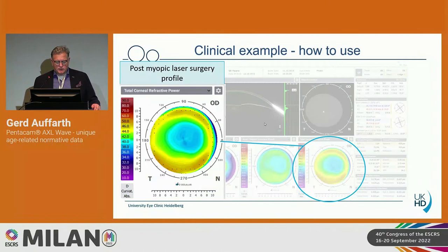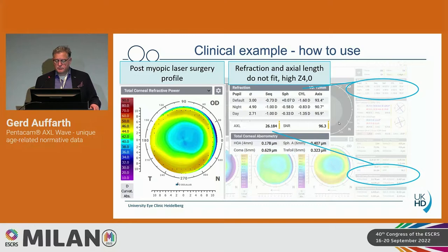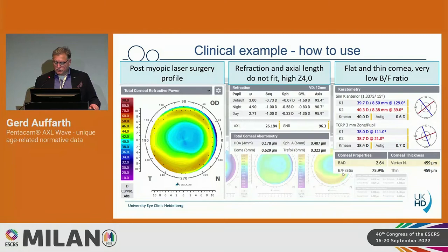Here's an example of a post-myopic laser surgery profile. On the total corneal refractive power map, if you look at the axial length, this should be a myopic eye, but it has only a refraction of minus one or even less — so the laser vision correction process can be identified. High order aberration with spherical aberration of 0.4 is fairly high. The flat and thin cornea and back-to-front ratio at 75.9% — if it were around 80%, it would be a normal eye — all confirm this is a post-LASIK eye.